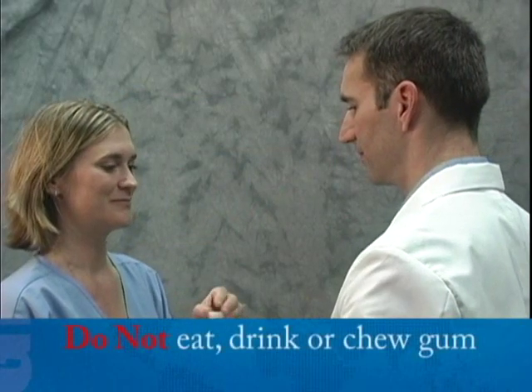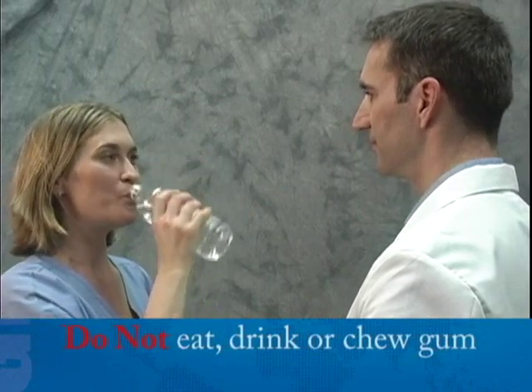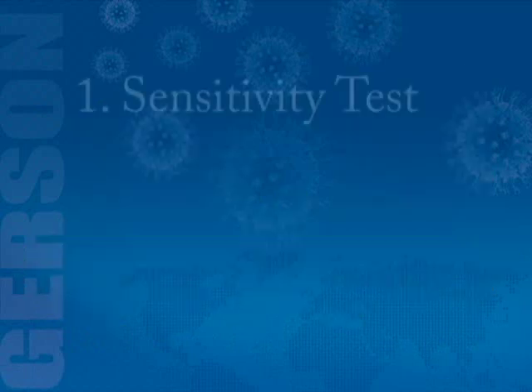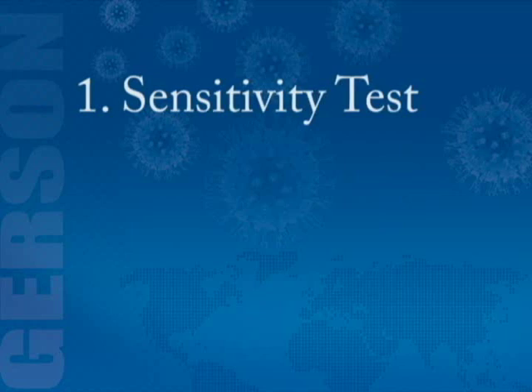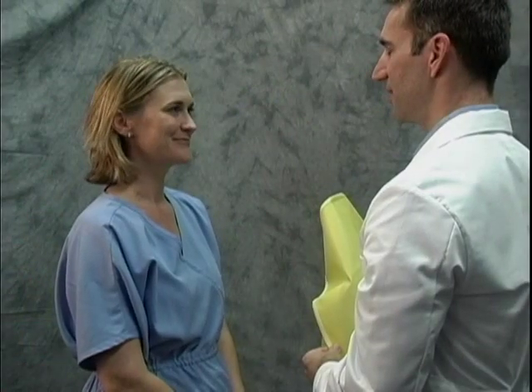Because this is a taste test, you cannot eat, drink, or chew gum for 15 minutes before the test. The complete test is broken down into two parts: the sensitivity test and the fit test. The first step is the sensitivity test — it establishes your ability to taste the test agent. You don't wear your respirator for this step.